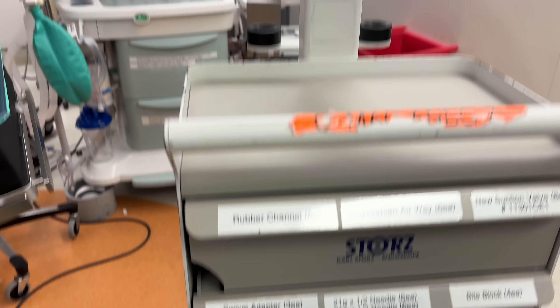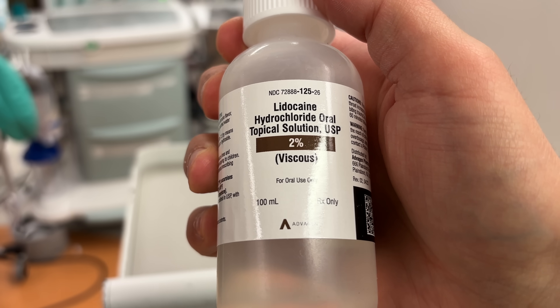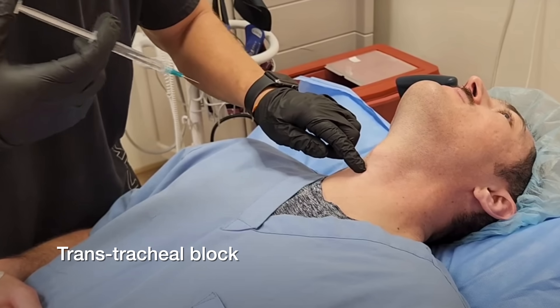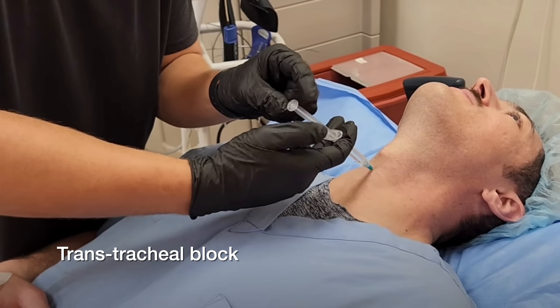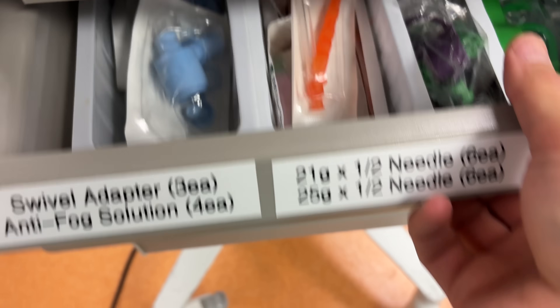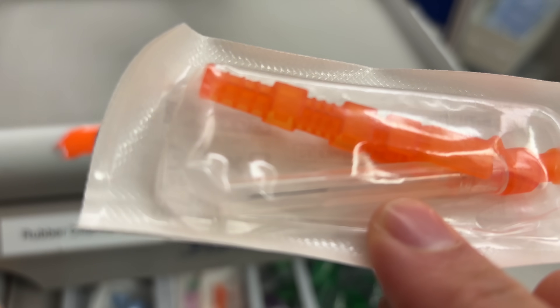One of the most important strategies to make awake intubations more comfortable is lidocaine, which is a local anesthetic that comes in a number of different formulations and can be administered in a number of different ways. There's no single best way to administer lidocaine — it's really just a function of what the anesthesiologist is most skilled at doing so they can help the patient feel comfortable. As you saw in this video, it's possible to spray the windpipe itself with lidocaine administered through a needle through the front of the neck. This is called a transtracheal block. On top of that, there are even more blocks that can be administered inside the patient's mouth to get the very back of the throat covered.